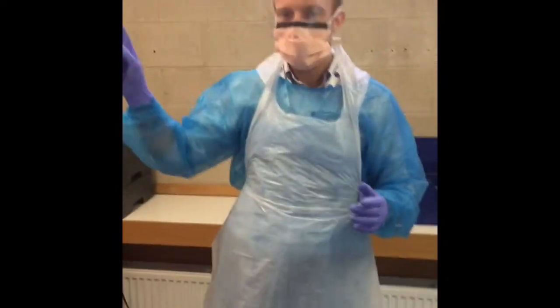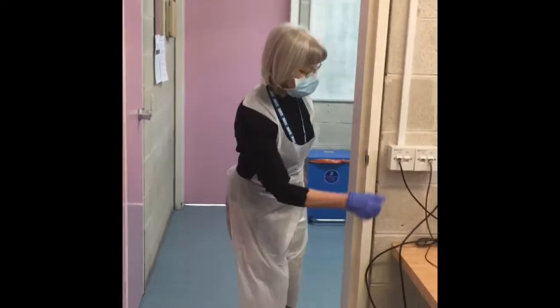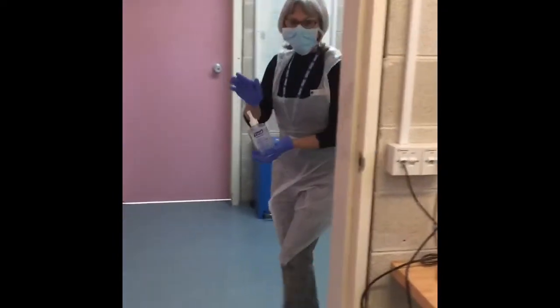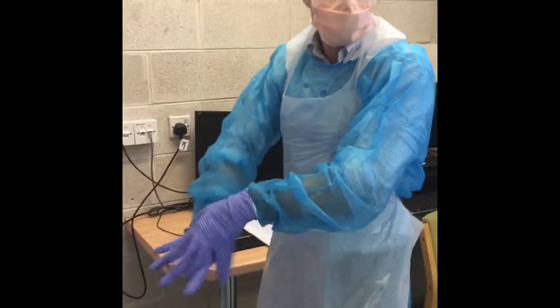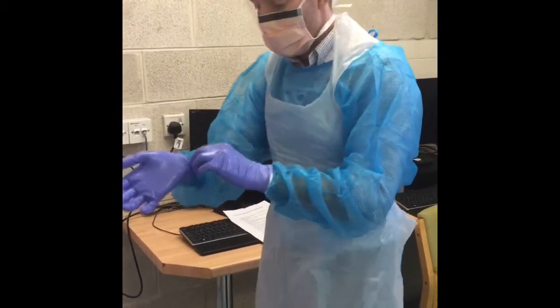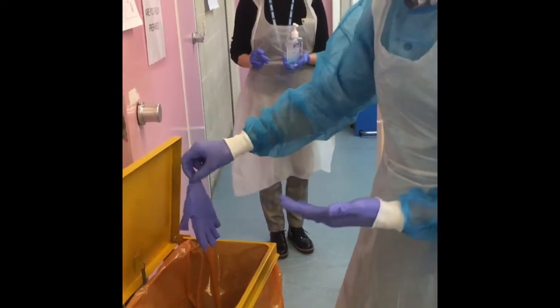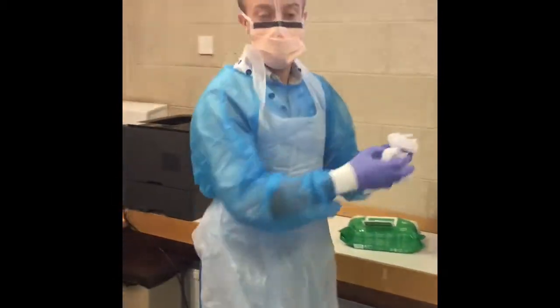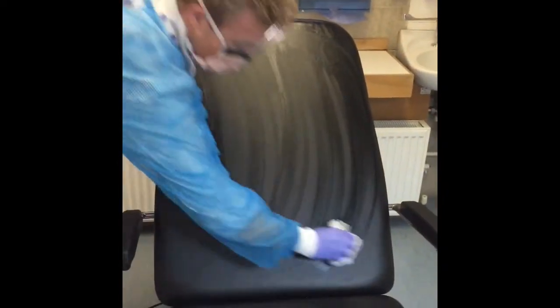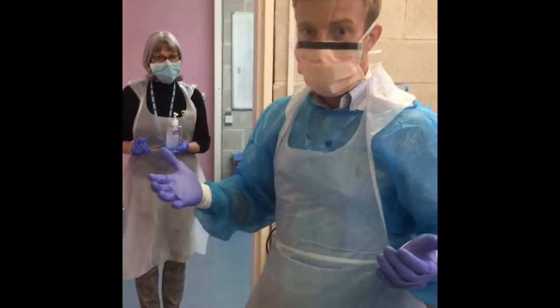Sarah's going to go back around the outside into the green zone now and then help me doff and clean the room. Initially I just need the hand Purell gel. So you're going to clean your dirty outside gloves first. You're going to do your A-lift technique. Then you're going to take your first pair of gloves off and drop them into your bin only touching the rim. The patient's not touched the door or anything — they've only touched this so you're going to give this a good wipe down. Any kit that you've used go through the same process — probe step back into the box — they also go into your dirty waste.